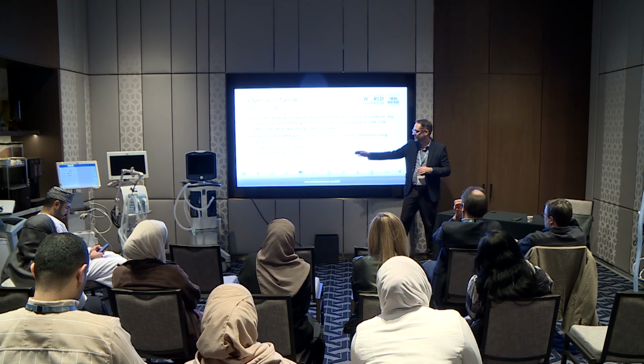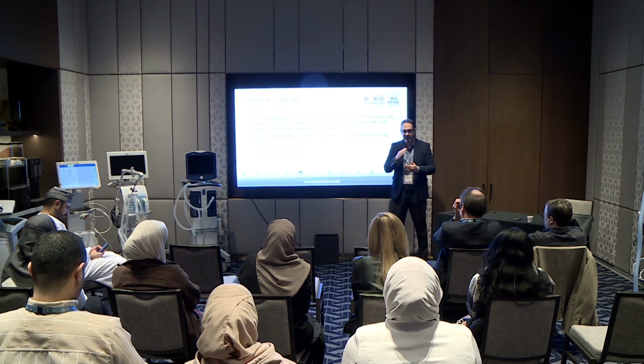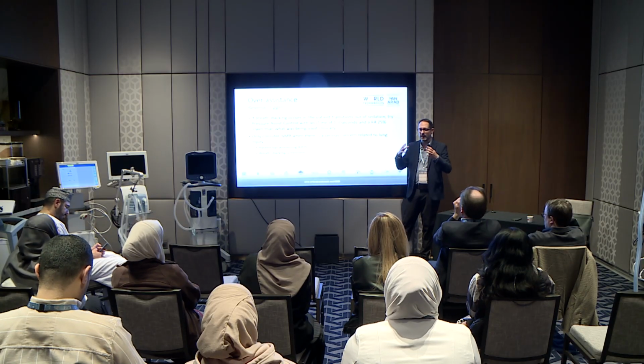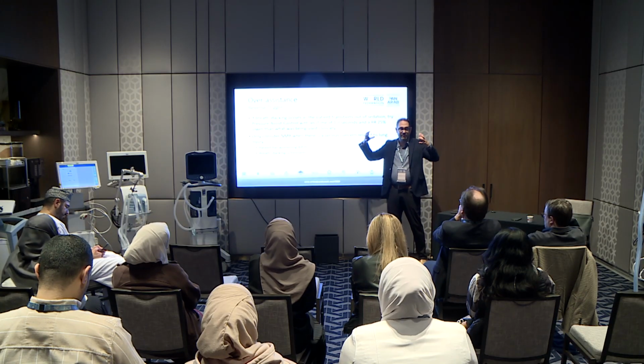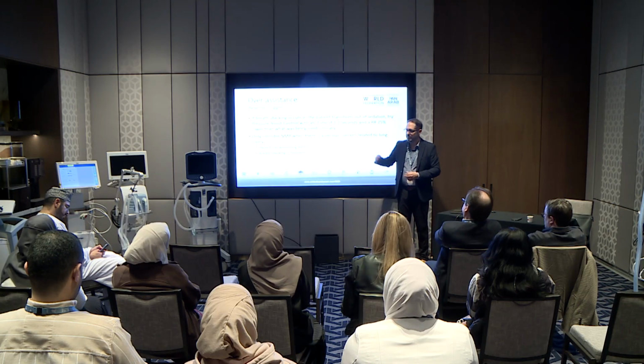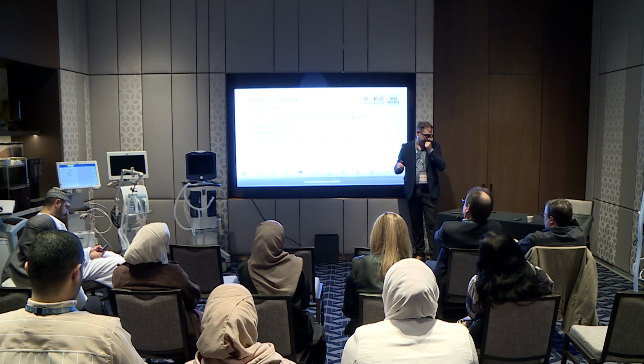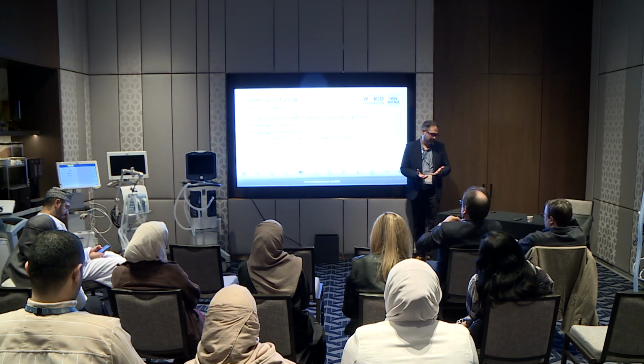The only time I would consider that is if the patient has worsening ARDS, they have reverse triggering with breath stacking, so we know there's a risk to having 2 volumes delivered every time they take an effort. That would be the only time I would consider something like that. So whether it's lung injurious, we don't know. Diaphragm injurious, we don't know.